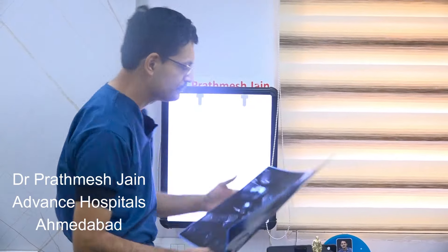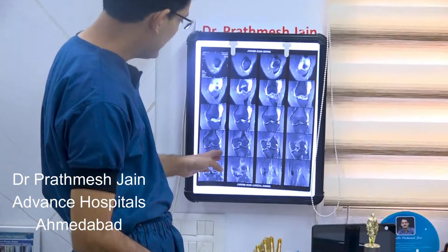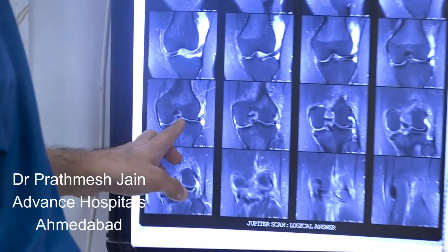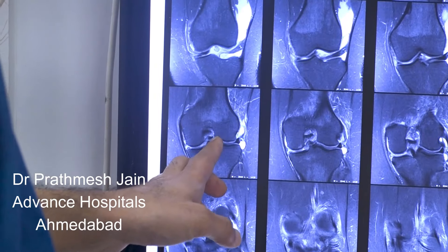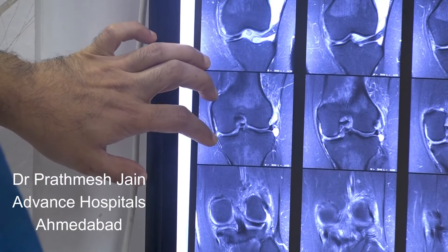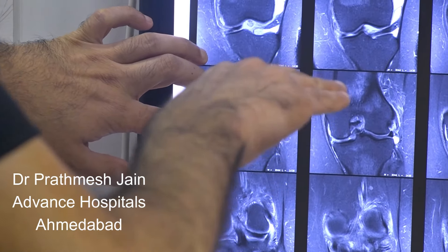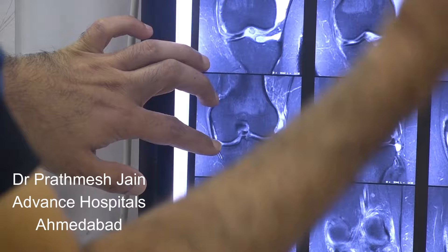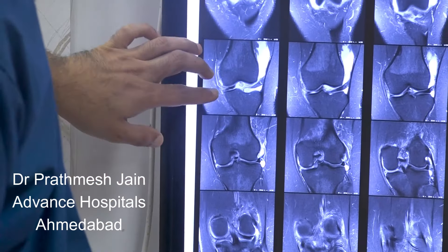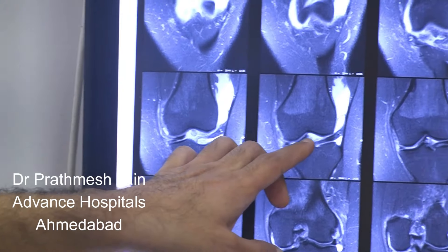On the coronal sections, you can appreciate that the meniscus fragment is seen here — this is the locked bucket handle fragment which is into the notch. There is no meniscus seen in its normal position because it is a locked tear which has flipped into the notch. In the anterior notch, you can see the meniscus anteriorly.